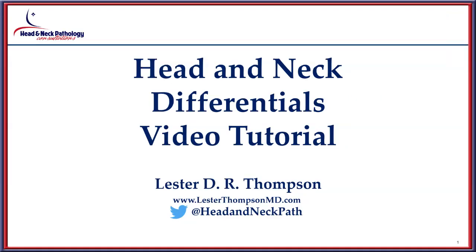My name is Lester Thompson, and I'm going to be doing a video tutorial on head and neck differential lesions.